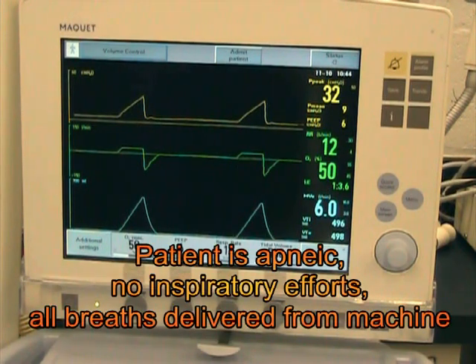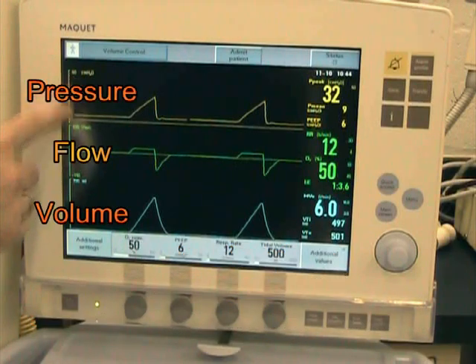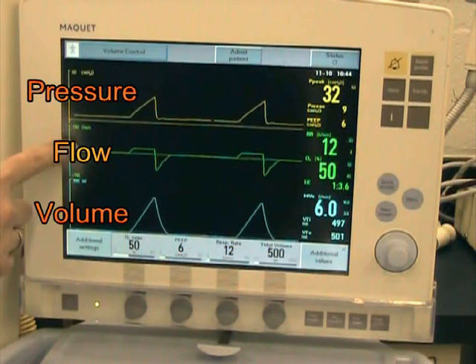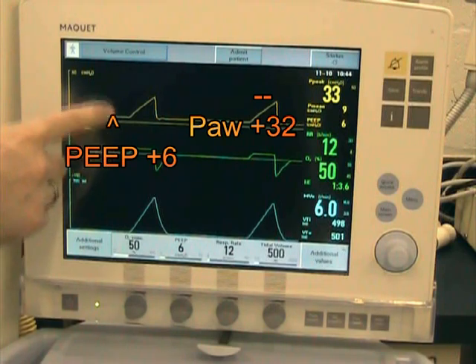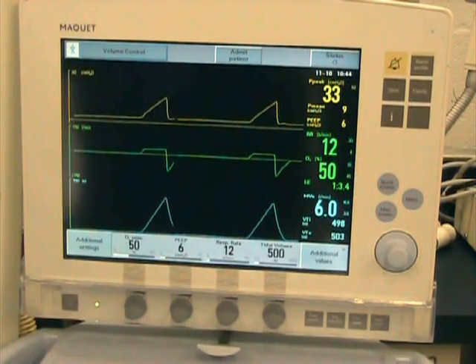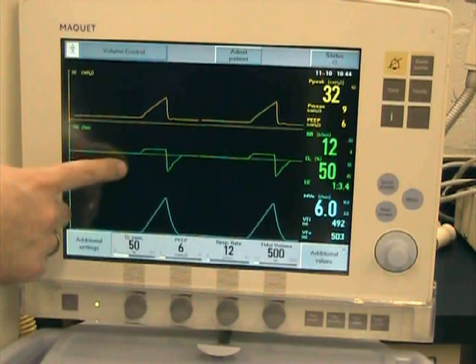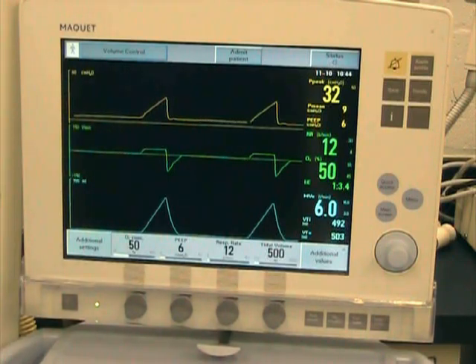This is the volume control mode for a patient that would be apneic. In both the pressure and flow, we do not see any patient efforts being taken, and in the event that the patient starts waking up, you will begin to see some triggering.